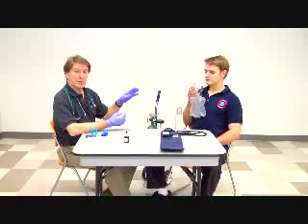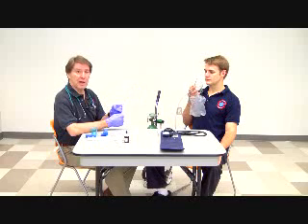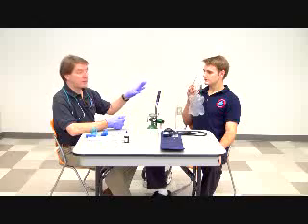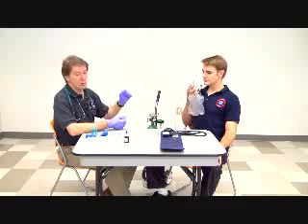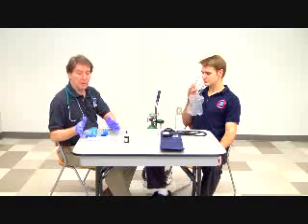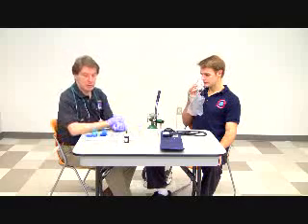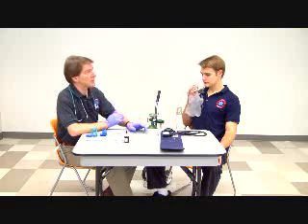This nebulized medication treatment is used in many instances for patients who have respiratory diseases such as asthma or chronic obstructive pulmonary disease. Our next step is to call and obtain a physician's order for this procedure, and assuming that the physician gives us an order, we're going to go ahead and next gather our equipment. The equipment that you're going to need includes the nebulizer itself, which is here, the medication that you're going to administer to the patient, as well as the equipment necessary to take the patient's vital signs.